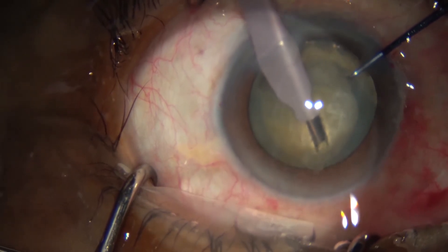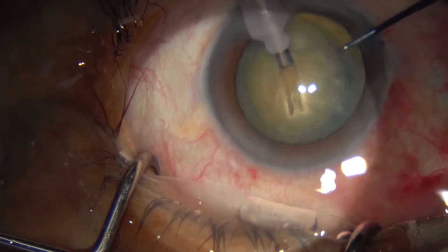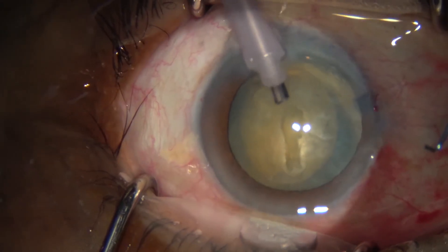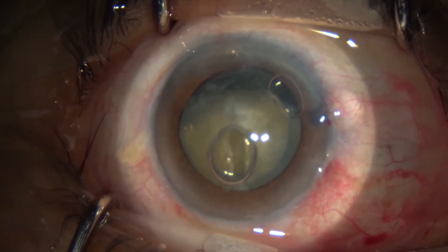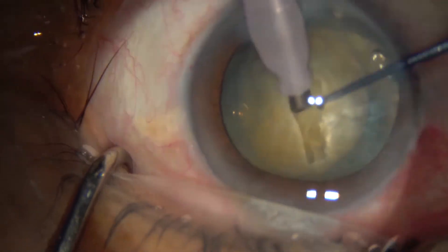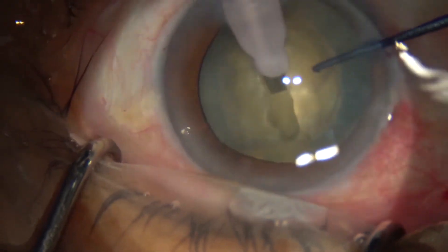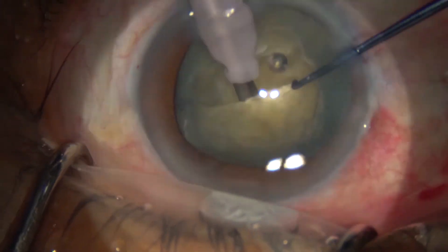Using the phaco emulsifier, we use the phaco tip to create a groove in the center using the sculpting mode. As you can see, it's an incredibly white cataract we're operating on. Once we make that groove in the center, we rotate it by 180 degrees to make the groove even deeper and to lengthen it.